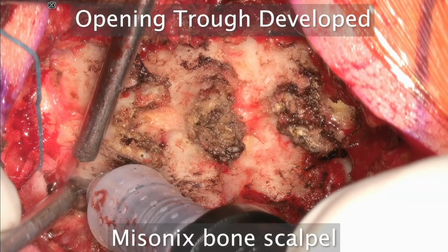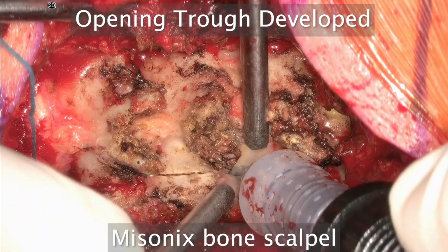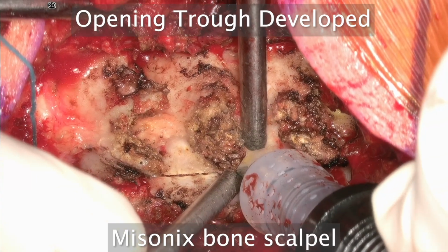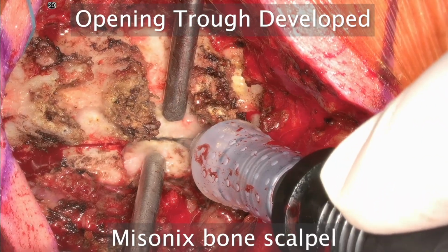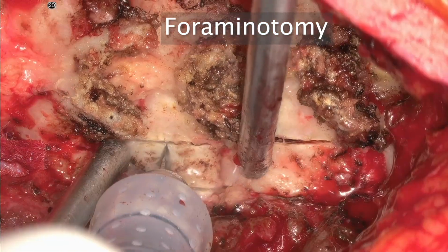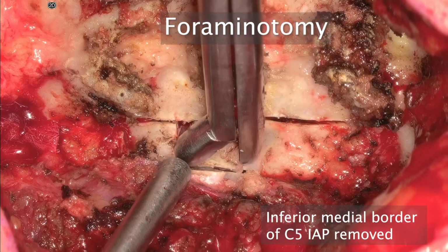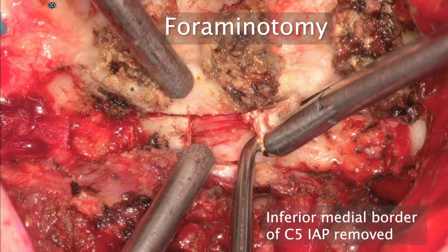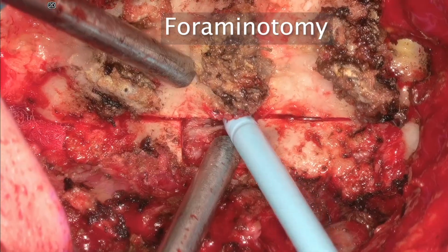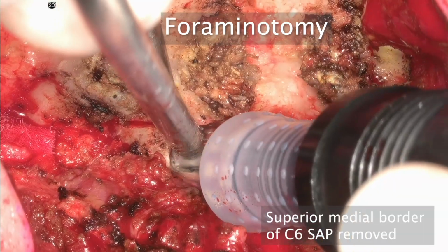So on the ipsilateral side, where you're seeing the most compression is where we're going to have the opening trough. So in that case, we're slicing or cutting all the way through that bone, essentially creating a complete fracture. Now on the contralateral side, we're having that hinge trough. And in that case, we're working through 3 layers of the cortex, that would be the cranial, caudal, and the dorsal cortex, while leaving that ventral cortex, which is necessary in order to induce that greenstick fracture.